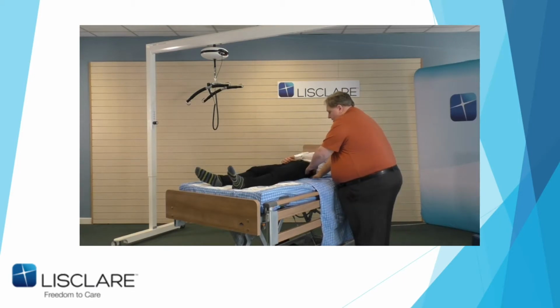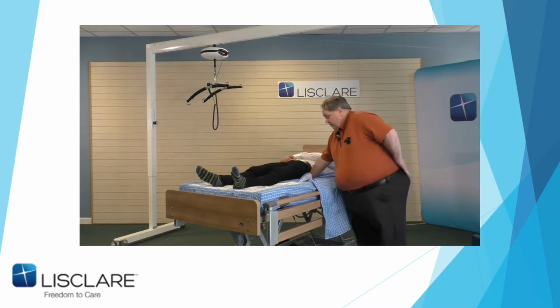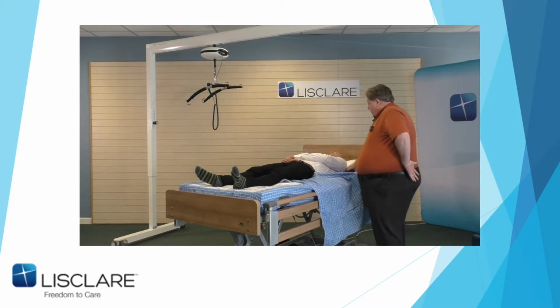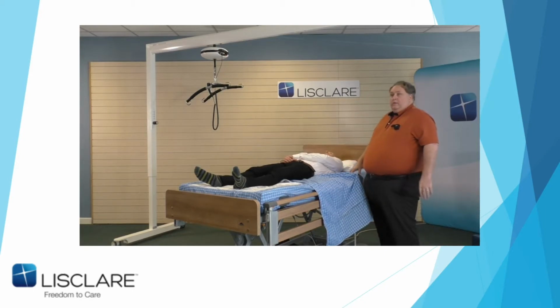So I'll just place one hand underneath John's hip bone. And if you can see, I can use my body weight, which makes it easier. And there's John moving to the center, underneath the shoulders, over. So at no point, I know I didn't pull the side rails up, but the reason being is it's only up the bed. The side rails will come more involved when I do turning.